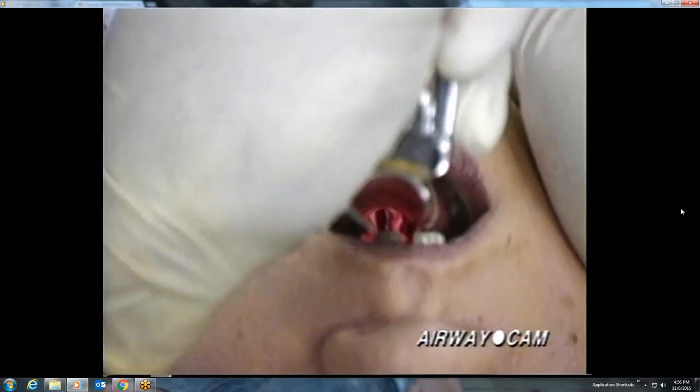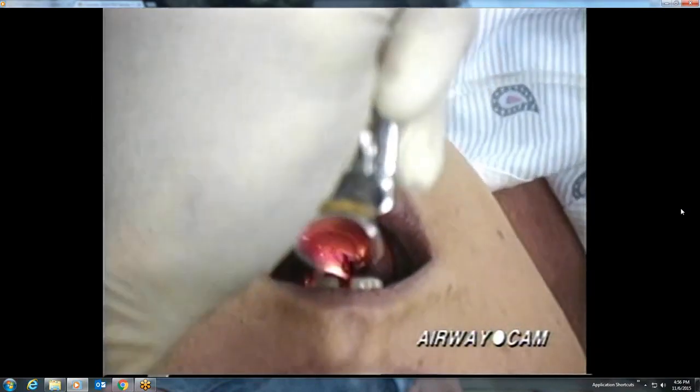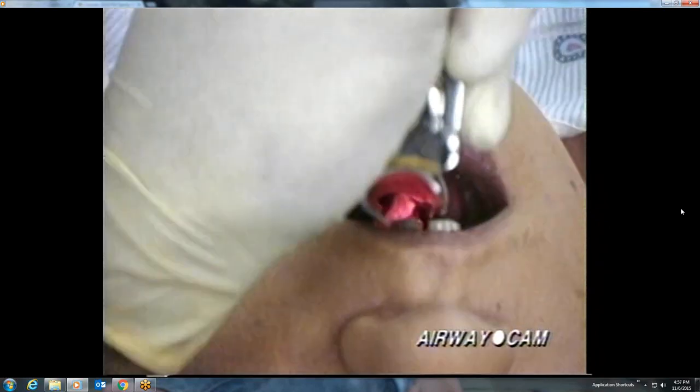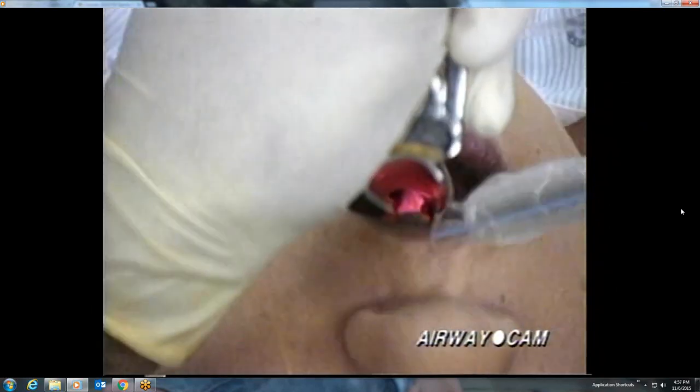Notice how the laryngoscopist changes the angle of the blade and re-advances in order to pick up the epiglottis. This happens several more times before the epiglottis is controlled. Finally, the posterior cartilages and glottic opening are seen, and an attempt is made to pass the tube.